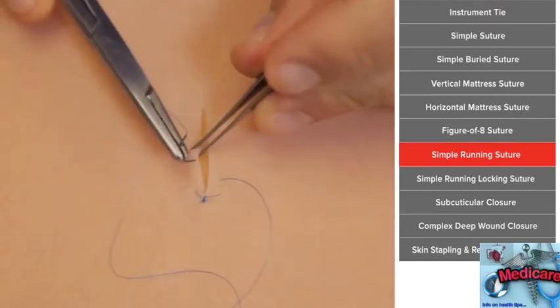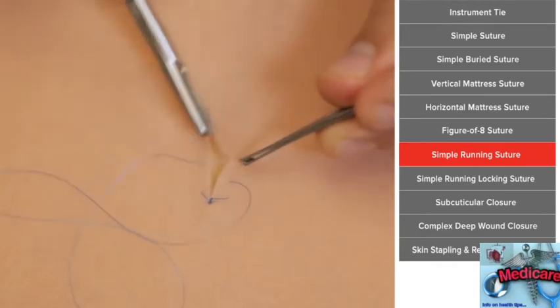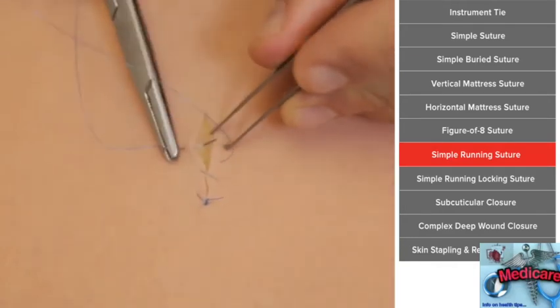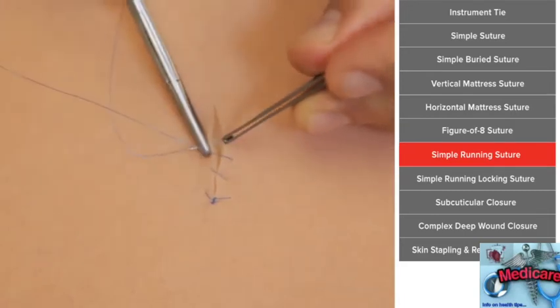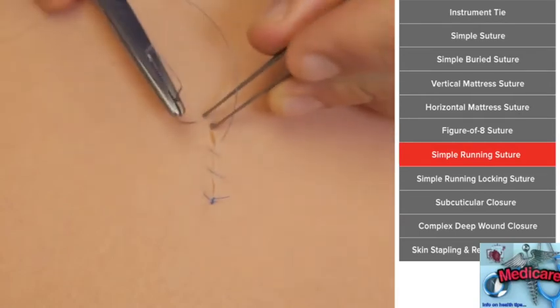So here it's just a few millimeters on each side. Move along the same distance. Here, a few millimeters. Take the same distance bite on each side, and again, as you start to get better and better, you can just go faster and faster. What's going to look nice is that you've done it exactly the same way each time.